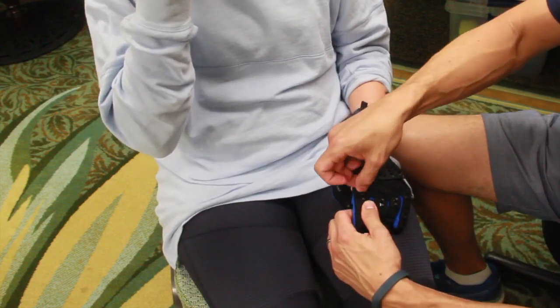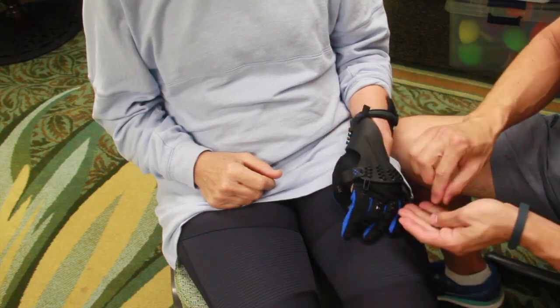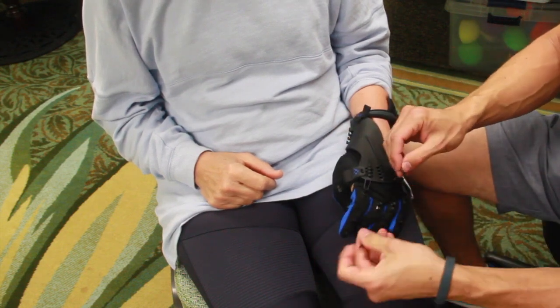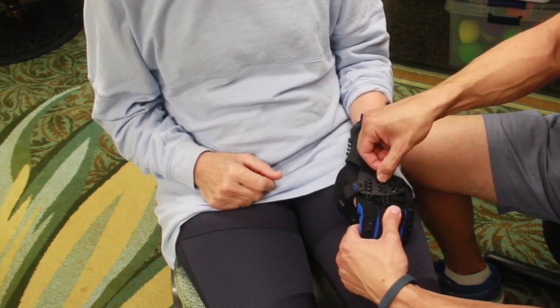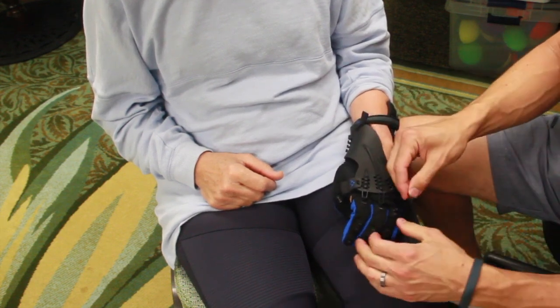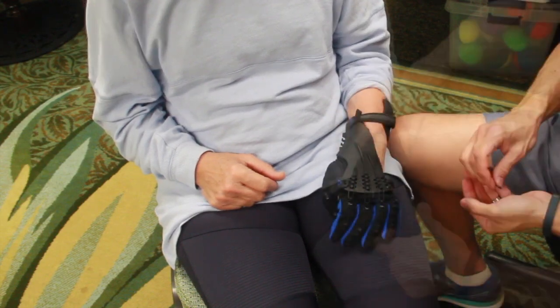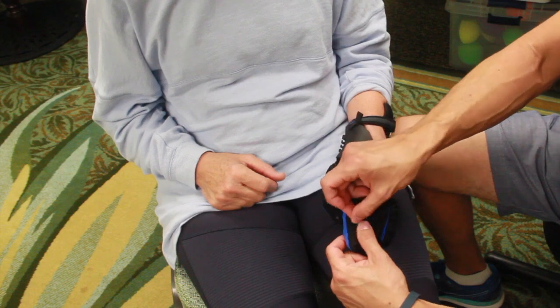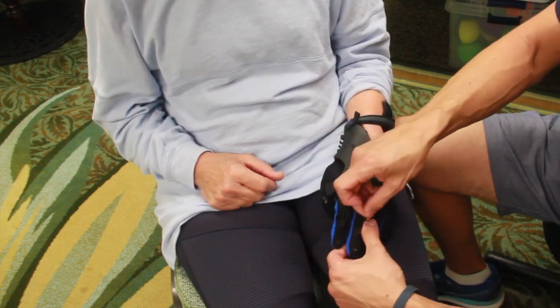You'll see the tensioner case that comes with the glove has a variety of sizes. So you'll want to pick the tensioners on the back of the case, which indicate which joint would require what type of tensioner based on the size. So here I like to start with the tensioners on the big knuckles first. That's called the MCPs. Then I'll progress down to the middle knuckle, which is called the PIP joint.